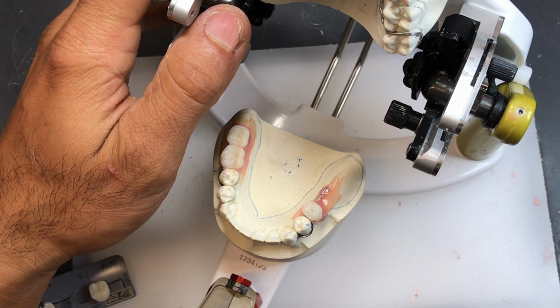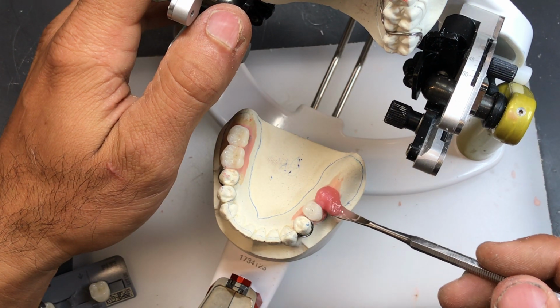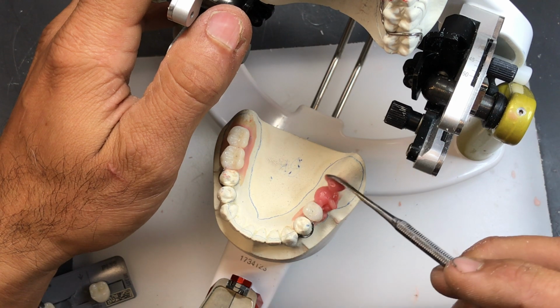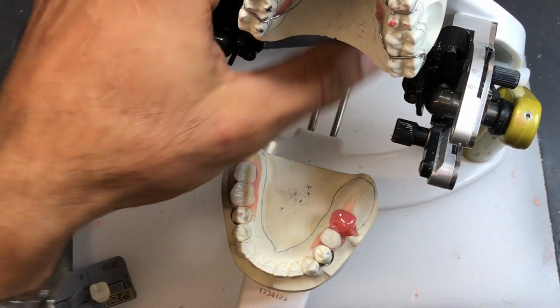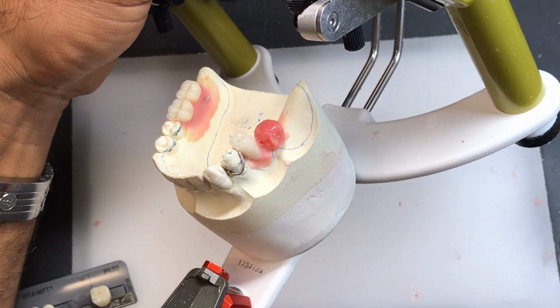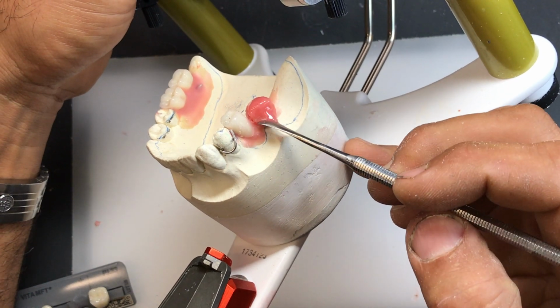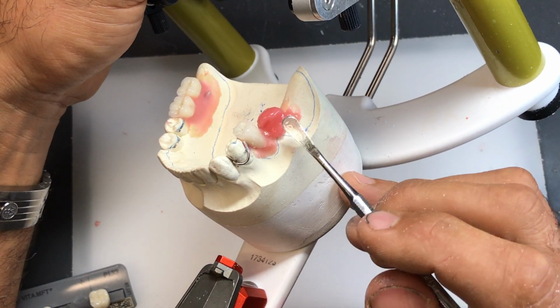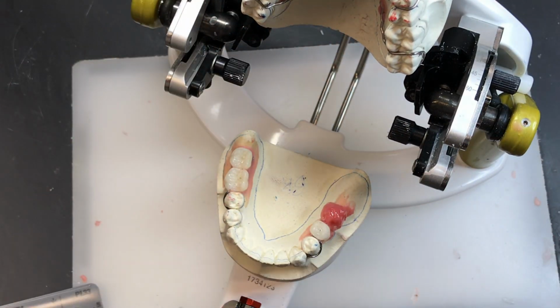seal it first, and then place some wax, maybe a little bit more, in order to support the tooth at the right vertical height. So we can do the same thing. Incorporate a little bit of selective grinding into the tooth to maximize centric occlusion. Let's see if that works.